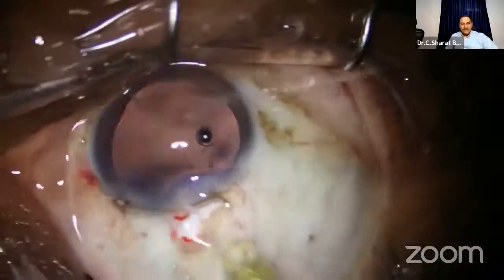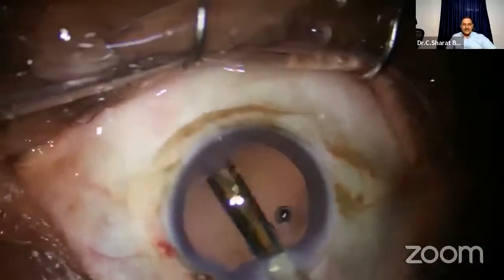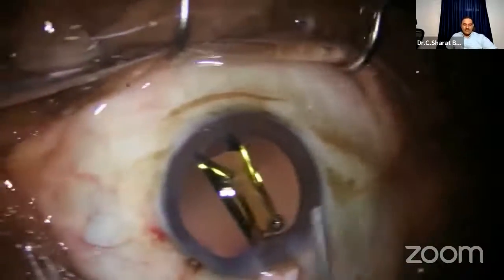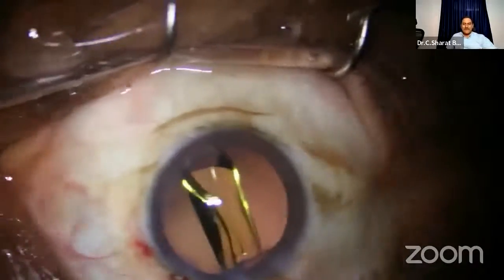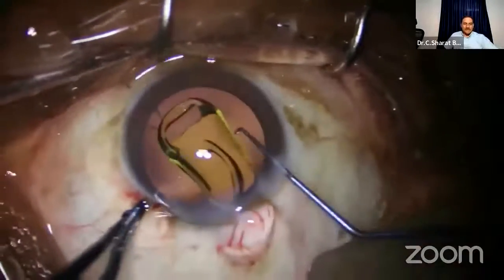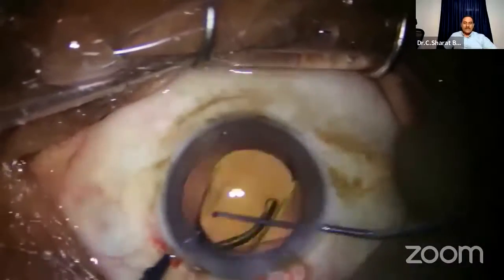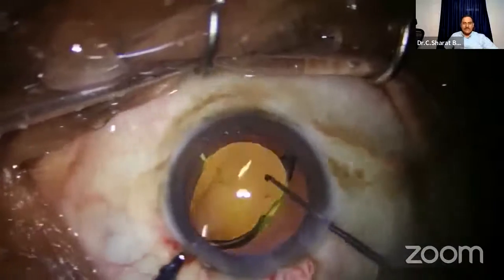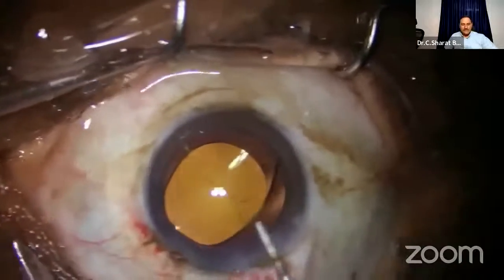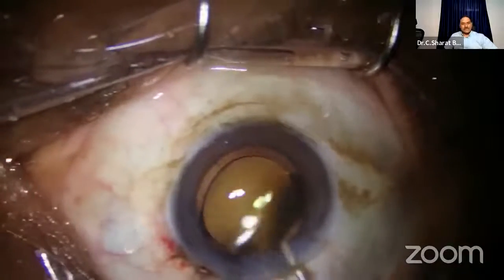While putting the IOL, put a lot of visco and push back the posterior capsule. See that the IOL is just below the anterior capsule, then come out and push again. Put a lot of visco on top, push the IOL behind, do the rotation and then place the IOL in the bag. This was under topical anesthesia. After that, the IA and cleaning the methylcellulose from the anterior chamber behind the IOL is what we normally do.